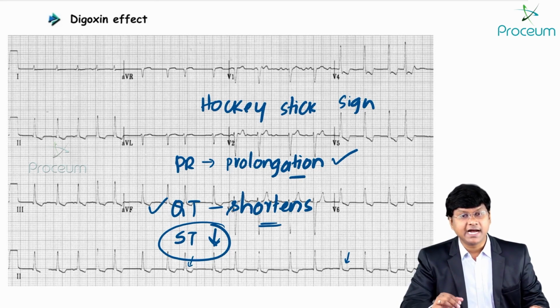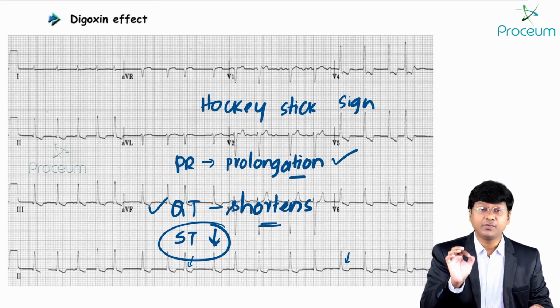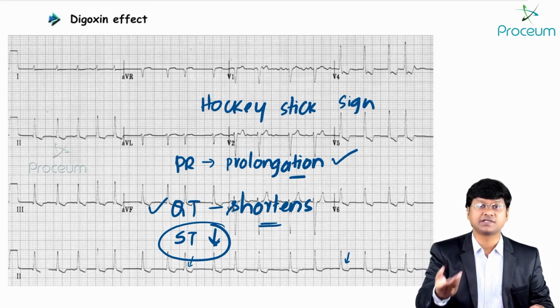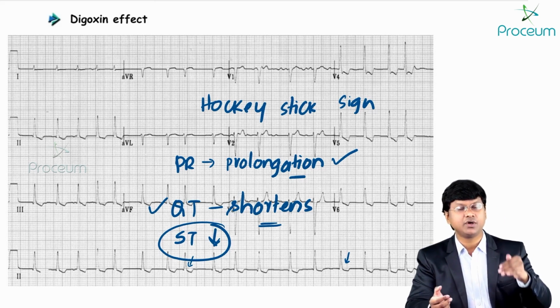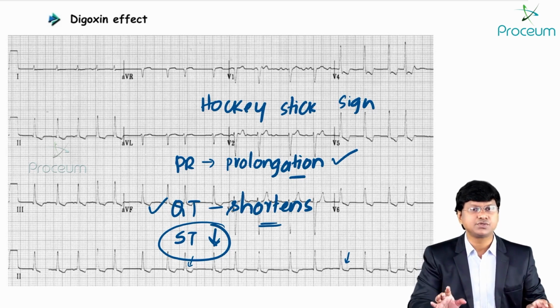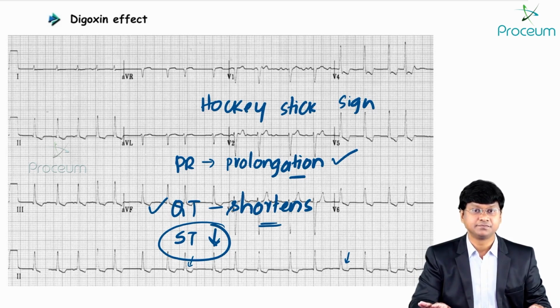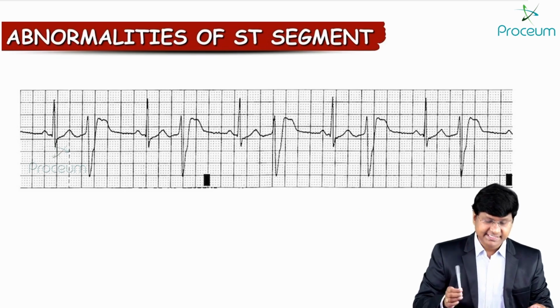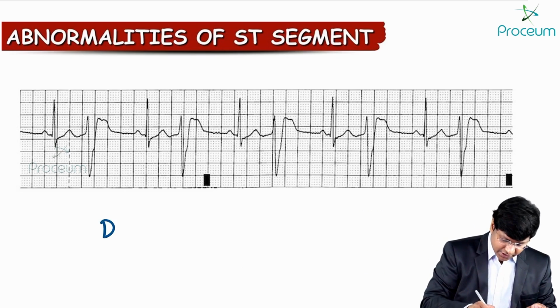Okay. Now, after having discussed the digoxin effect, what will be the features of digoxin toxicity? Digoxin effect is different. Digoxin toxicity is different. In digoxin effect, you have only the ST segment depression. But I'll show you one more ECG here. This is the ECG of digoxin toxicity.